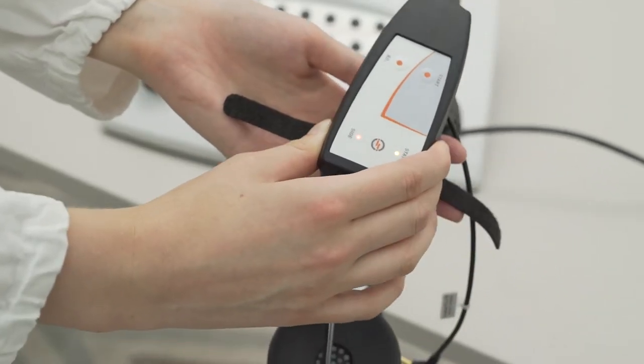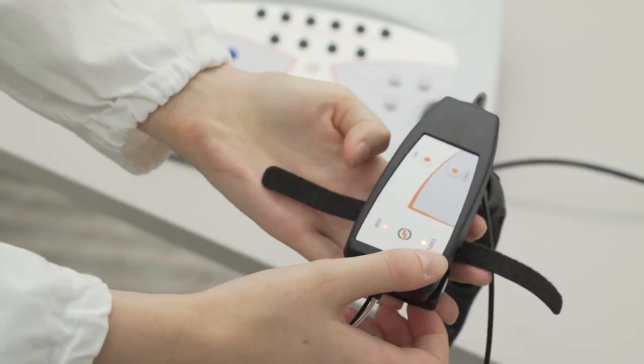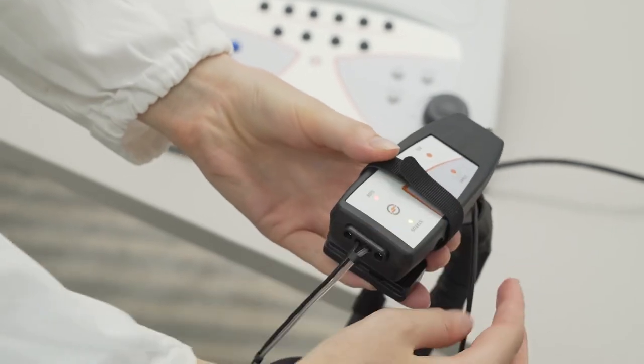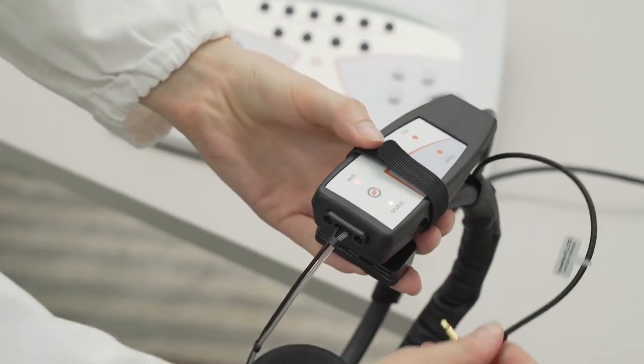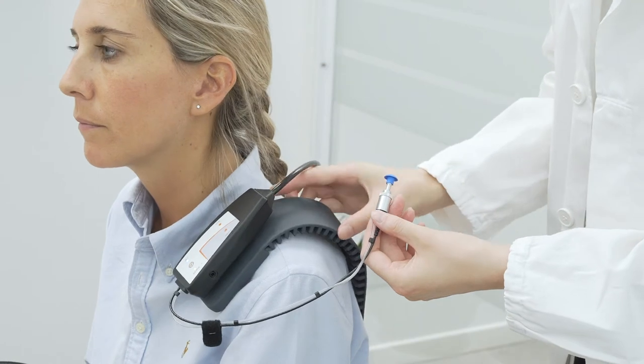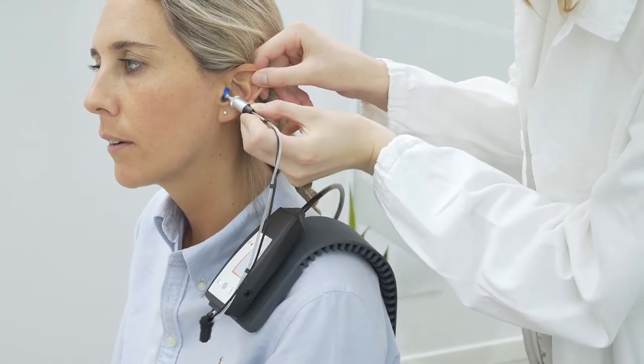Flute's probe is extremely light, small, and made of metal, and it can be very rapidly disassembled and cleaned. The probe can be mounted on the headset of the contralateral headphone using the headband buttons, or in case you opt for an insert earphone for contralateral testing, it can be mounted on the shoulder strap included.